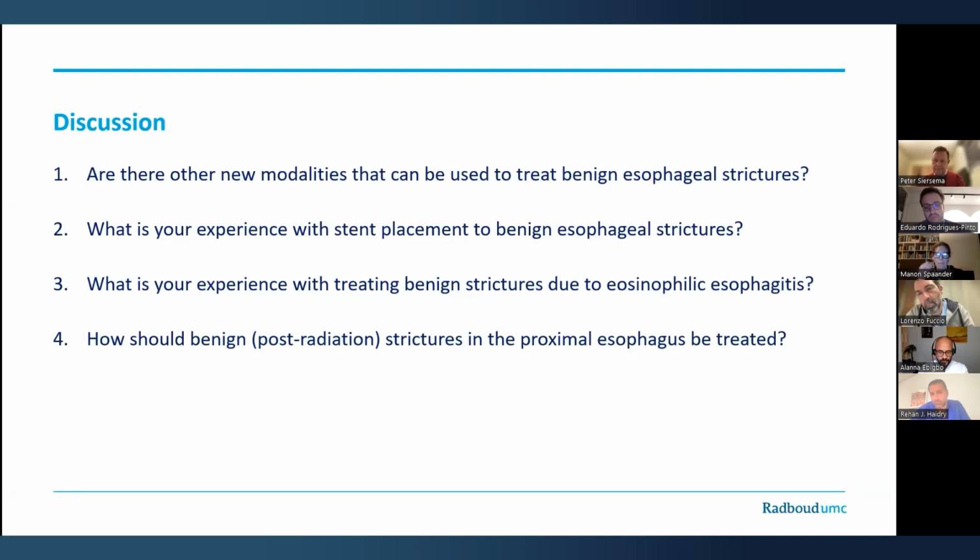We now have some very, very nice cervical stents, which are proximal release. So in some patients, these can be used just to temporize things for 4 to 6 weeks before you jump to other dilators. But the other thing, Peter, that has been very effective in our centers is self-bougienage in these patients.